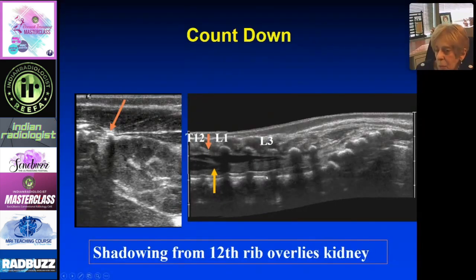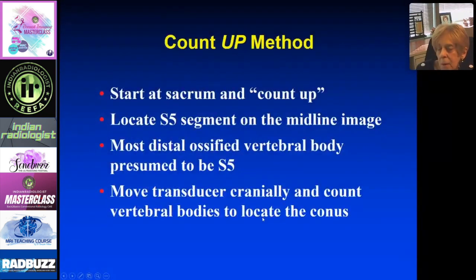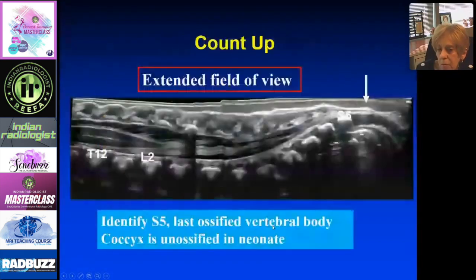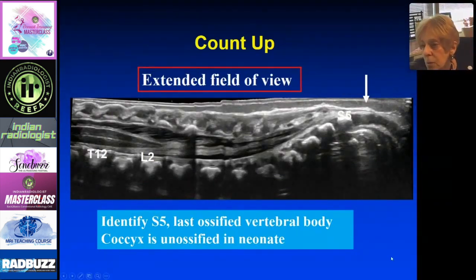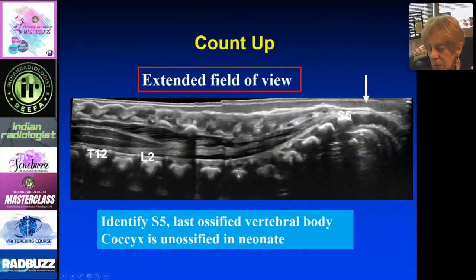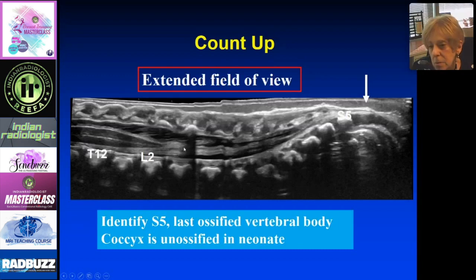Counting down is not a terribly reliable method. The preferred method is to count up — start at the sacrum and count up. Locate the S5 segment, which is the last ossified segment, and then count up through the vertebral bodies. This is where you need your extended field of view transducer to lay out the entire cord. The coccyx doesn't ossify, so S5 is last. Counting up: S4, 3, 2, 1, then lumbar 5, 4, 3, 2, 1, T12. In this example, the conus is somewhere between L2 and L3.